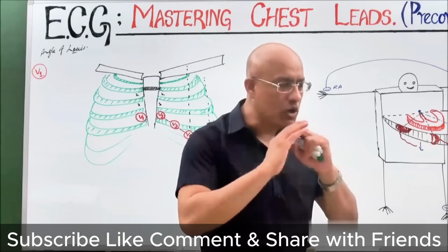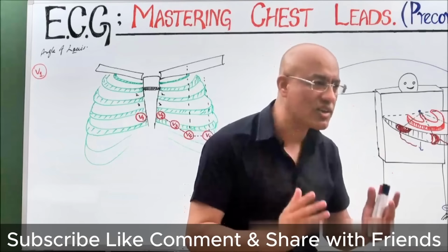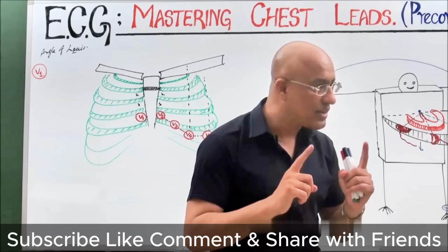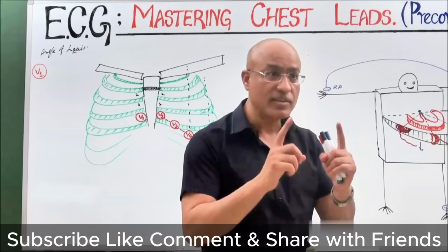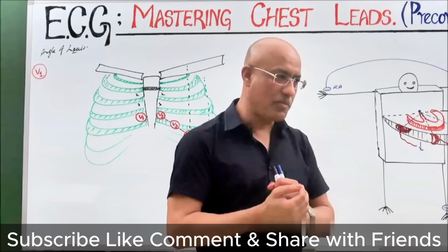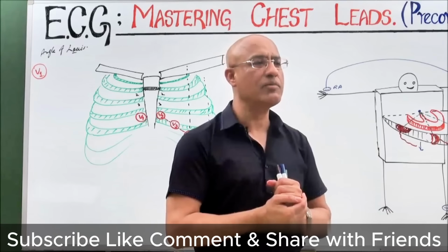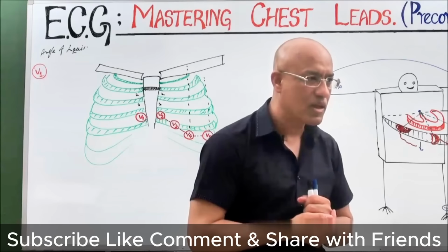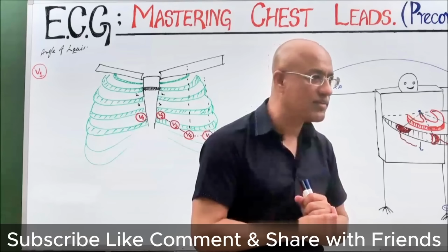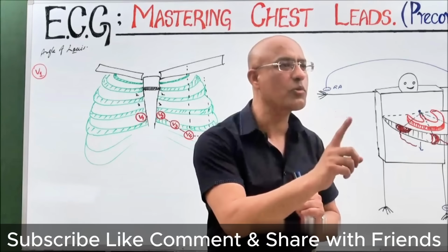But preferably forget about what I told you about young females. It's better not to talk about this breast issue and nipple issue, because these are chest leads. These are not breast leads. These are chest leads. Remember that. Why am I stressing this so much? Number one, nipple position problem. Number two, sometimes women come with a large breast, and a very young doctor gets confused about where to put the leads. What will you do? You will remember these are chest leads, not breast leads.